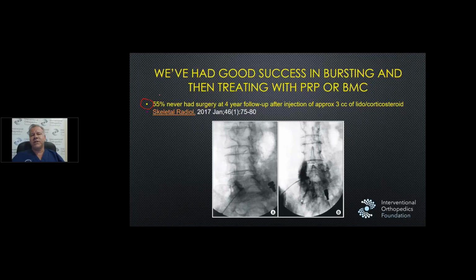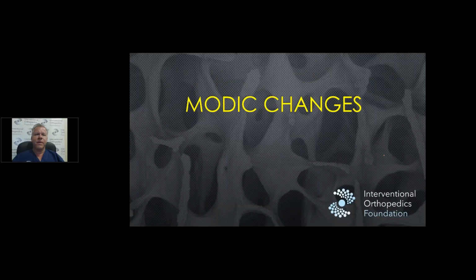In fact, the surgeons just produced a nutty study that seems to say it's far better to get surgery out of the gate than get an injection, which obviously doesn't consider that getting this injection is far safer than any surgery. And you do see this type of crazy large contrast spread when you actually go ahead and burst one of these. Sometimes they won't burst. They can be loculated in the more complex patients, but it's certainly worth a try at bursting them rather than a surgical procedure where you're going to destroy the multifidus just getting to this thing.